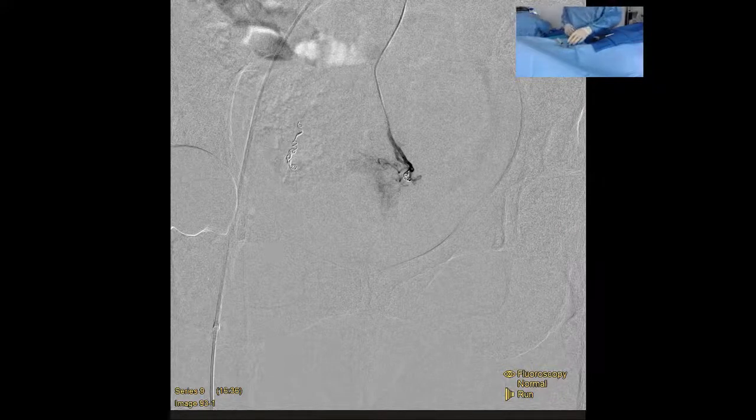Yeah, I agree. And my preference for why I tend to use these over the soft coils is because these have that fiber, and I think this is a good example. Both of us thought we'd blow right through here. But obviously we did. It's nice. So we'll go in here with one more coil. Actually, this is a soft. So let me see what you got over here. So you want a 2 by 4 interlock.